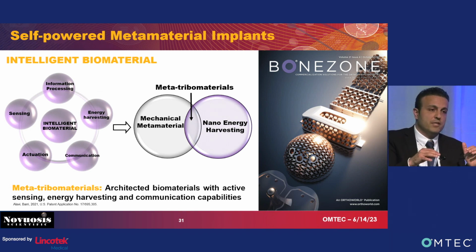Put simply, how can I design an implant, like a titanium implant, which gives me any desired mechanical properties or stiffness? Can I design it in a way that it gives me the same density as bone? The metamaterial concept is interesting because we can rationally design the elements of this structure or implant to come up with any desired mechanical properties.